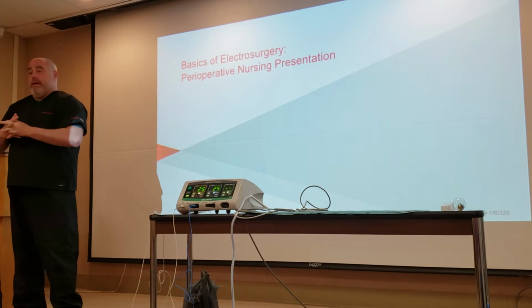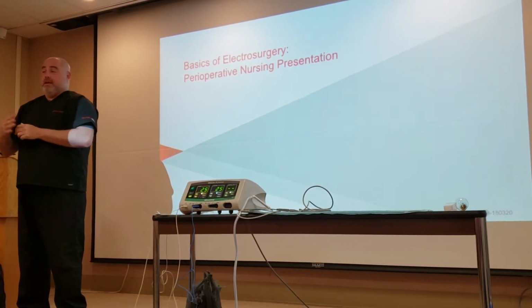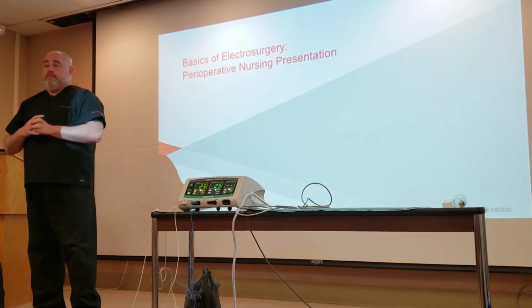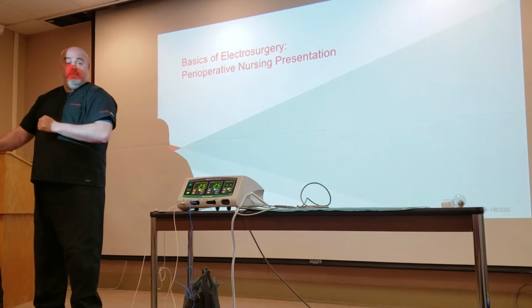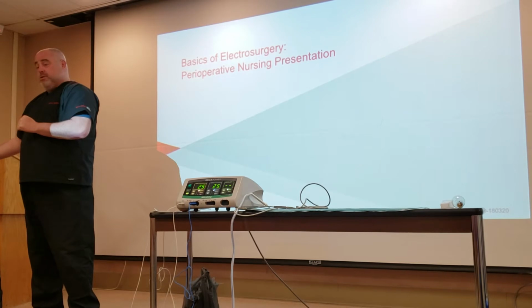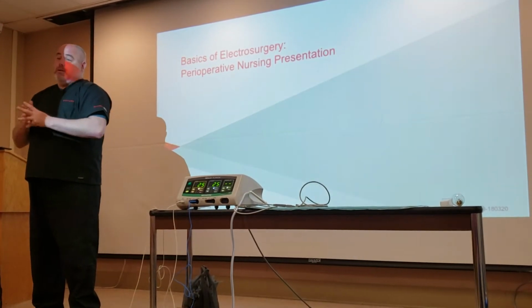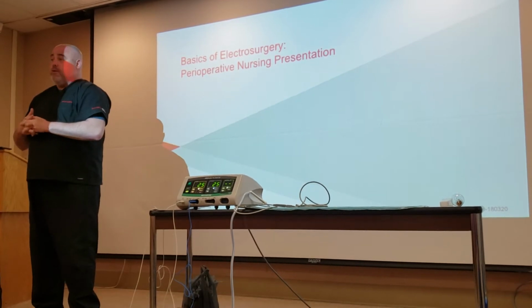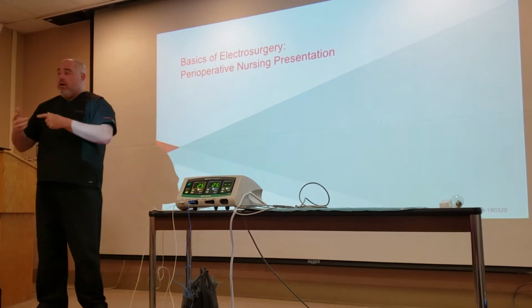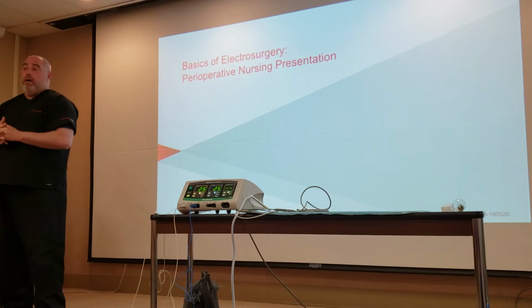What's electrocautery? You all have electrocautery devices in your house. I said branding iron. What's an example of an electrocautery instrument in your house? How about just a regular iron or a curling iron? I plug something in that uses electricity to heat up an element. Your toaster is an electrocautery device. If you're toasting bagels or bread in your home, you're using electricity to cause heat in elements that causes an effect on what it is that you're doing.